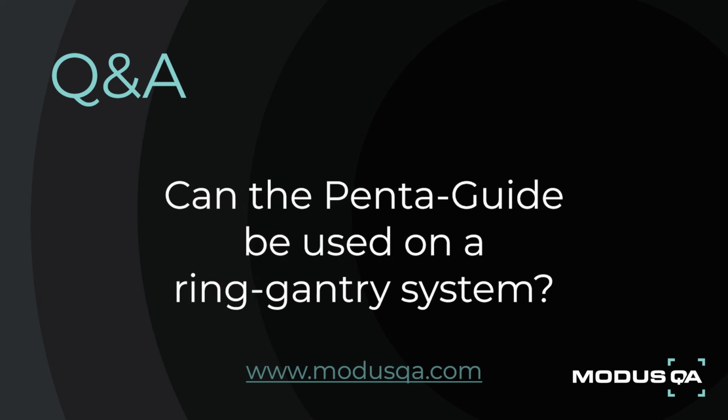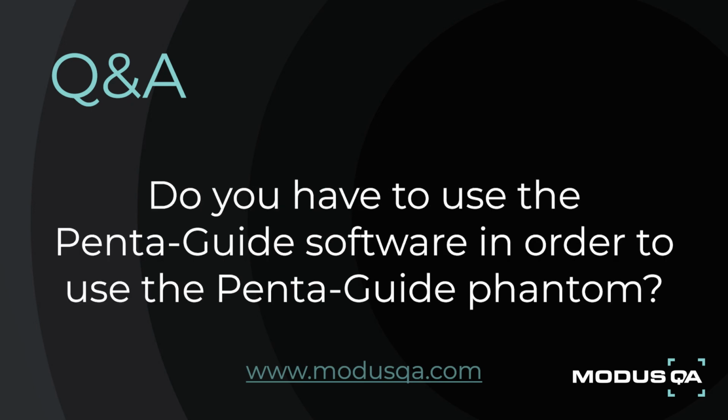Great, thanks. Can the Penta-Guide be used on a ring-gantry system? Yes, it can. So the Penta-Guide was designed for a traditional linac. However, it can be used with ring-gantry systems. So the Phantom can verify your 3D alignment using the sphere structures, and the projection images can verify your MV and KV alignment if the system has the capability to produce static projection images or the ability to perform MV cone beam CT. And the Penta-Guide software itself can process any cone beam CT as well as MV and KV 2D images.